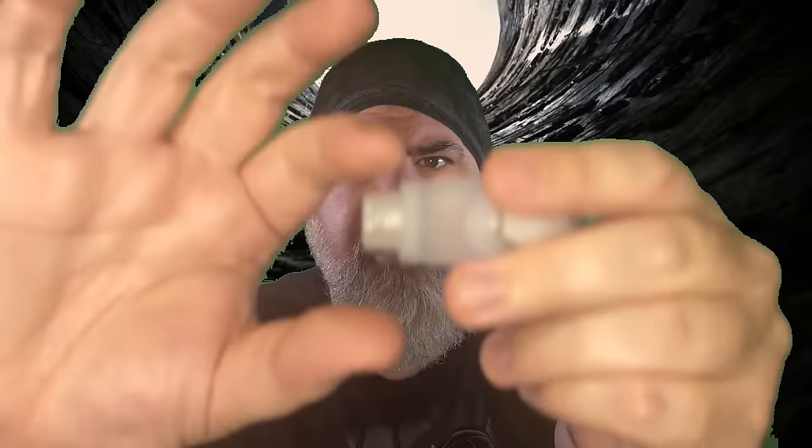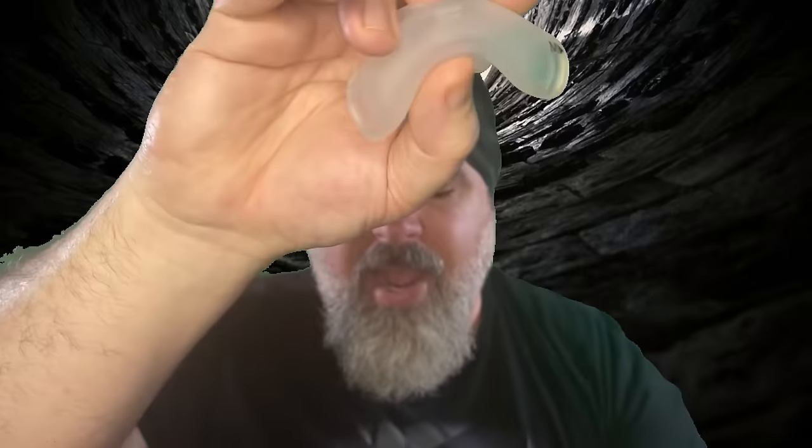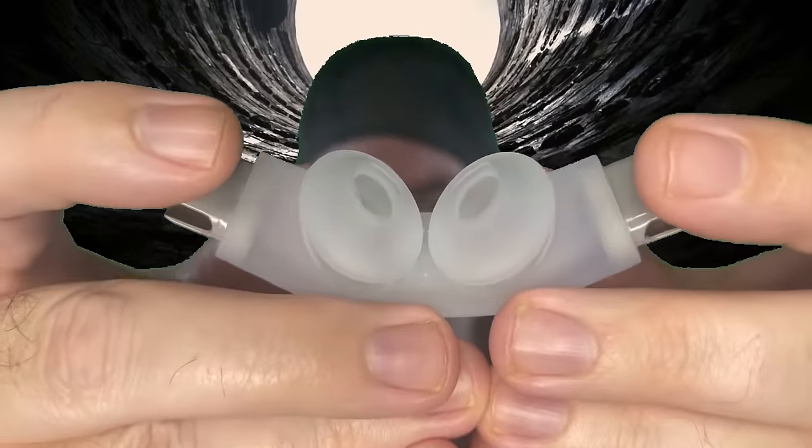By contrast, the ResMed nasal pillows are sort of unflexible, unyielding. They don't bend much, and that's for a couple of reasons. First, they put their clips on the mask itself instead of the frame. See, the Philips, the little clip goes into the mask. On the ResMed, the clip is on the mask, and that makes it structurally rigid and also very hard. There's also this diffuser here, which adds stiffness and rigidity.